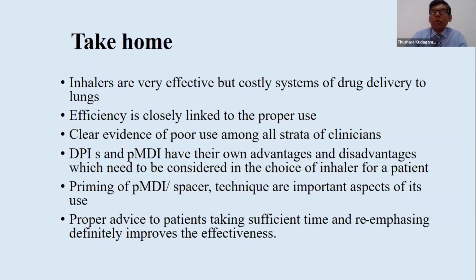So before wrapping up, some take-home messages. Inhalers are very effective but costly systems of drug delivery to the lungs. So it's very important, they're very costly. And though they are efficient devices, the efficiency is closely linked to their proper use. And there's clear evidence of poor use among all clinicians. Dry powder inhalers and pressurized metered dose inhalers have their own advantages and disadvantages, which need to be considered in the choice of an inhaler for a patient.